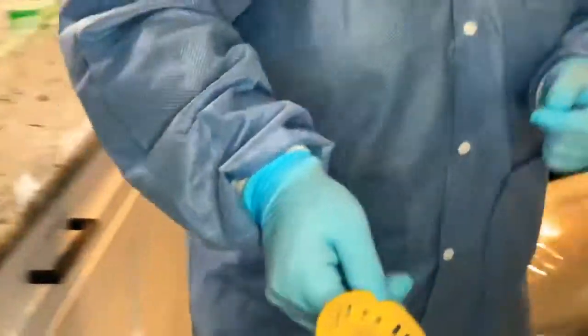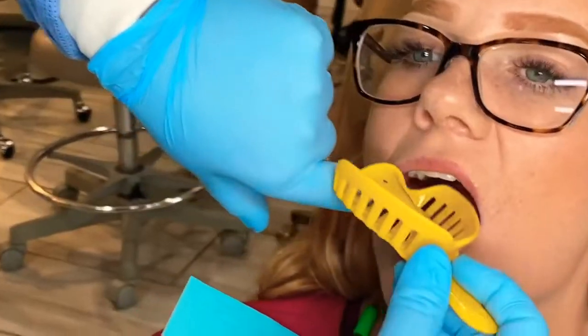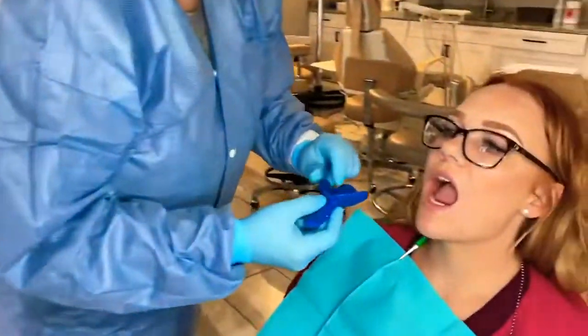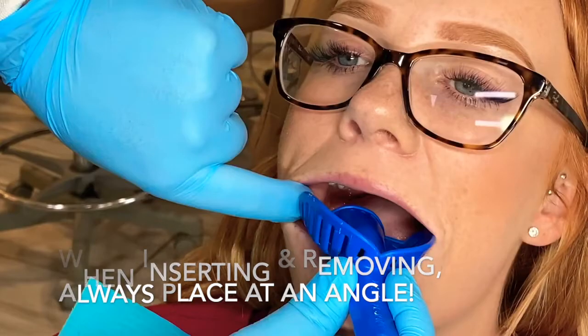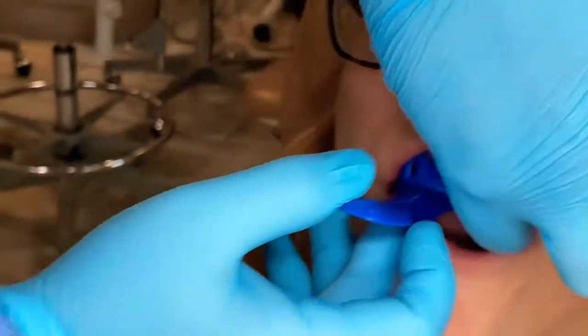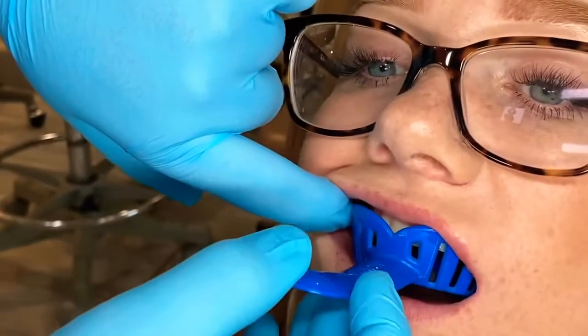I'm going to start off with the yellow tray. The impression itself is taken from the back, but I'm going to try it in from the front. I'm going to retract her cheek and try to go in this way with the tray. I can see that that's way too big for her mouth, so we're going to try the next size. I'm going to retract her cheek again — this one goes right in, but it's hitting the sides of her arches, so this does not fit.